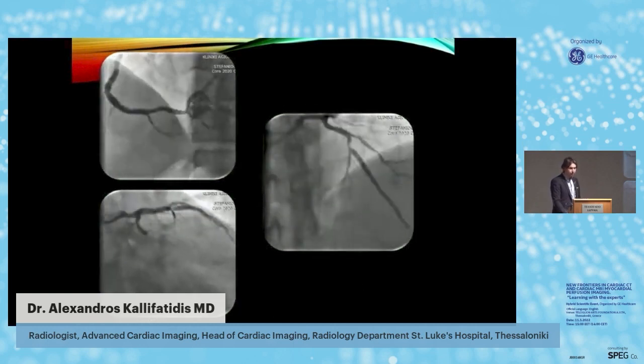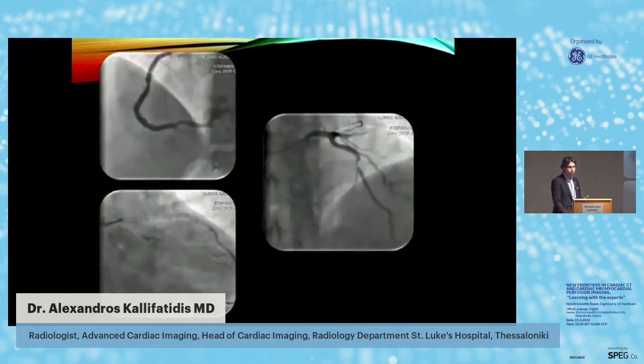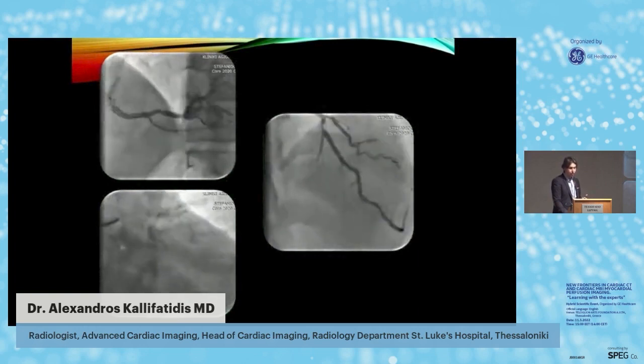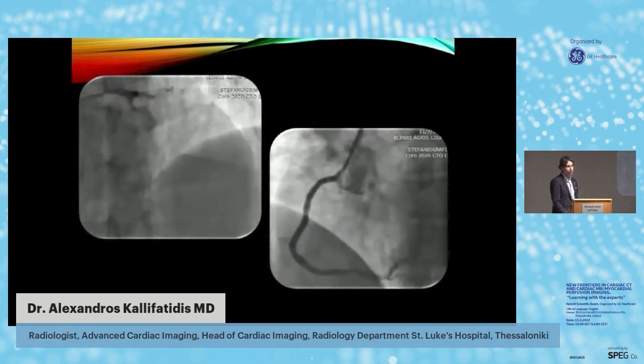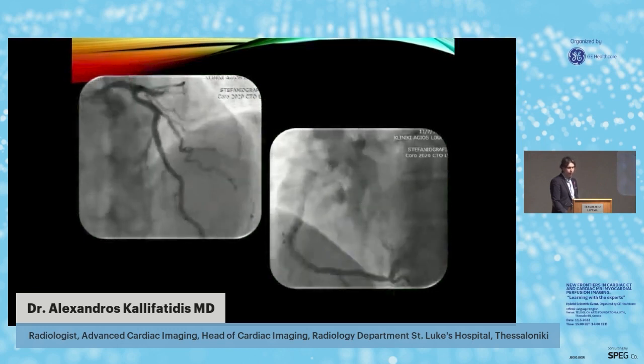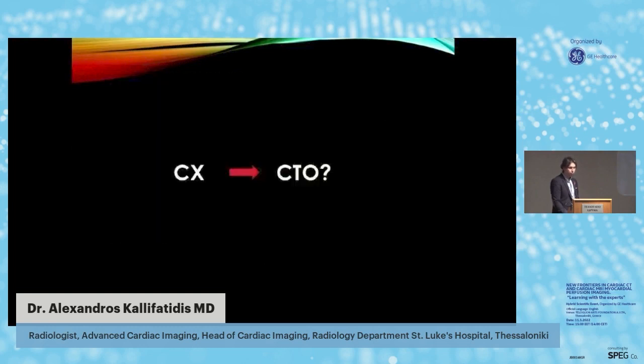What was the further management of this patient? Of course, this stenosis in LAD was considered to be the lesion responsible for this event. The patient had a primary PCI for LAD and right coronary artery, and here we see the excellent result. But what about the circumflex artery?